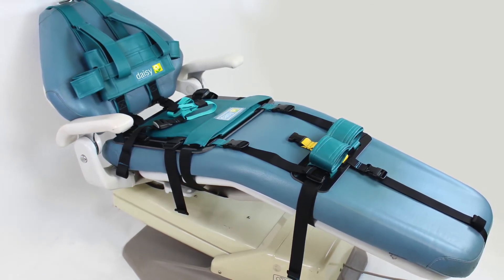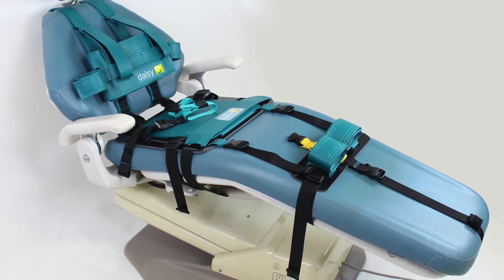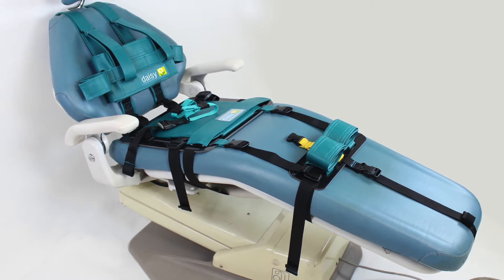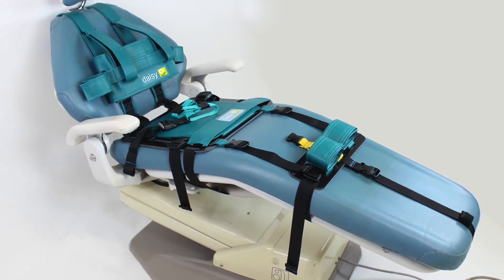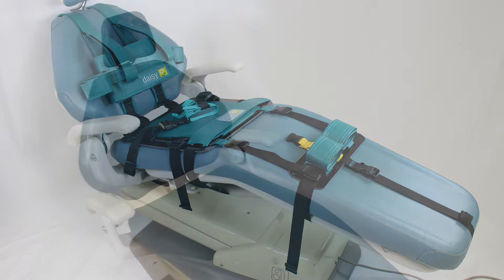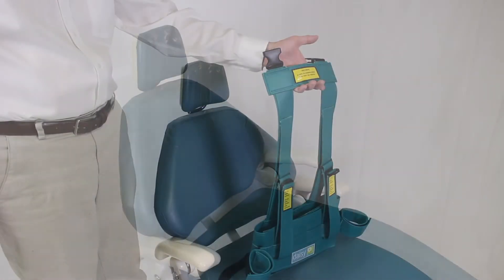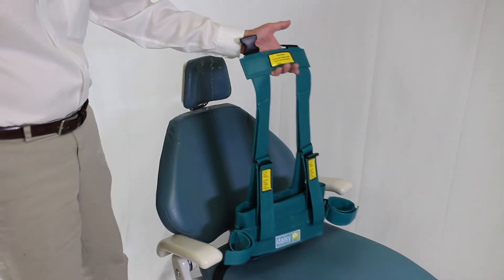The DAISY PSR is fully cleanable between patients and easy to store when not in use in the provided plastic storage container. This video is a step-by-step instruction for the installation of the DAISY PSR to the dental chair. It is important to install the DAISY PSR to the dental chair before the patient arrives.